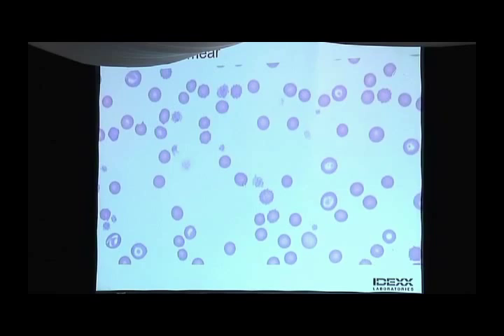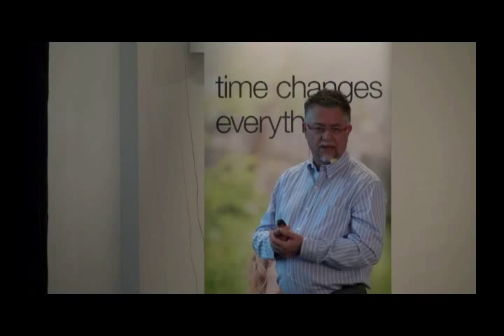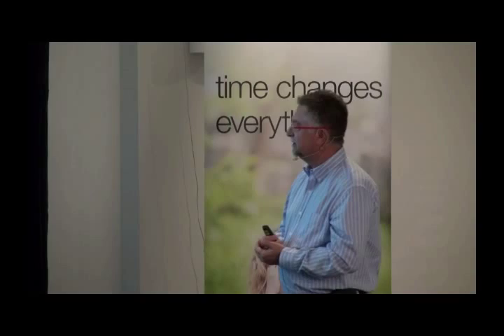Remind me, what do we call those red cells that don't have central pallor? They're kind of spherical. Hey, you see, you're paying attention. They're spherocytes, all right, very good. Okay, so we're seeing regenerative anemia with spherocytes, correct?